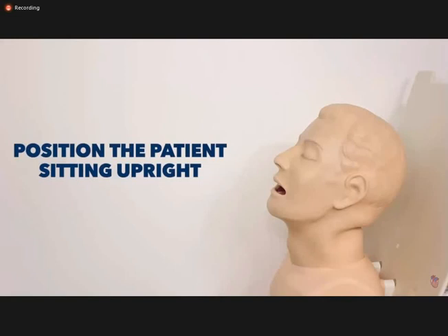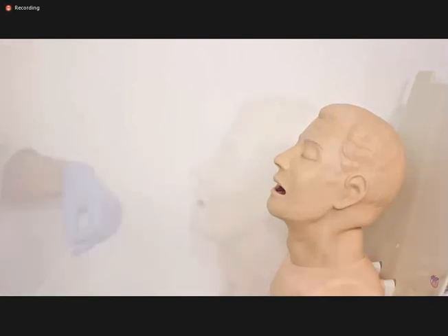Wear the gloves and don the apron, and position the patient sitting upright.